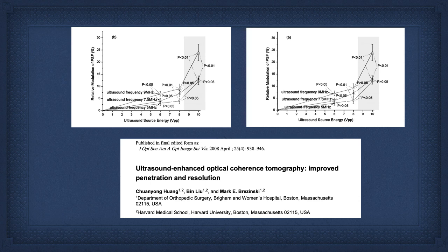If you look at it as a function of frequency or intensity, you get what's similar to the photoelectric effect. It's a quantized phenomenon, and that may not be very exciting to you, but it opens up the opportunity, because it's quantized, to really pin down tissue characteristics or to control the light waves.